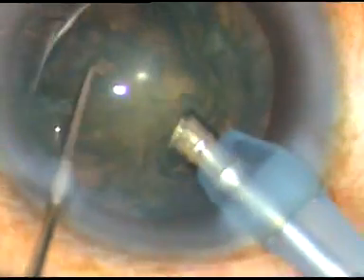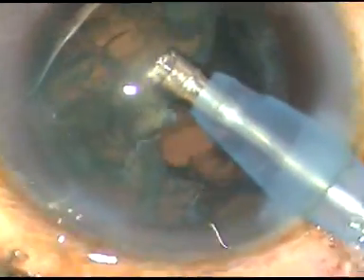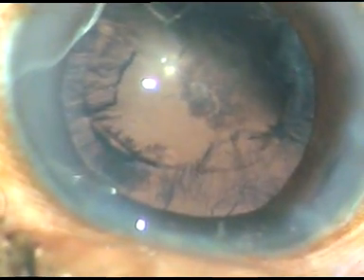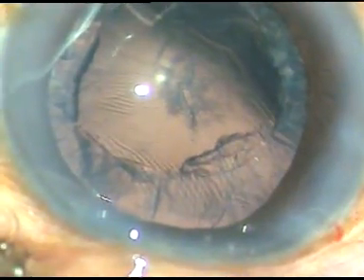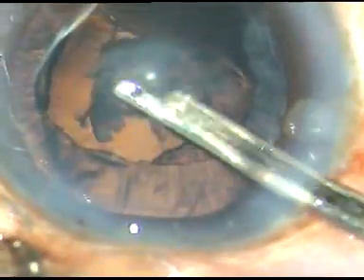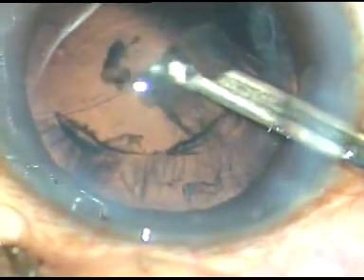Now the remaining portion of the nucleus is mobilized and emulsified. It is very safe and takes very little time. Since very little phaco energy is being applied inside the anterior chamber, corneal and endothelial decompensation is almost nil with this technique in soft cataracts.